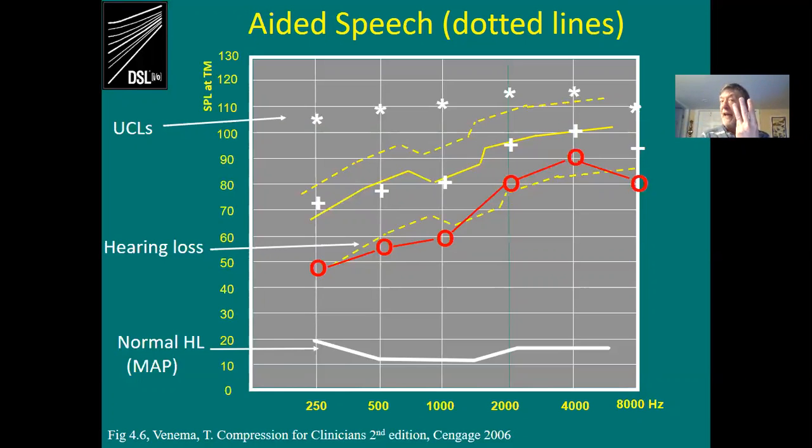And now we are looking at in situ output. Write those words down. In situ, I-N, in situ, S-I-T-U, in situation, in place, amplification, in situ aided response, in situ output. In situ, with the hearing aid, in situation, what's the output? And when you're comparing that to old real ear, basically all we care about is real ear aided response. R-E-A-R, real ear aided response.